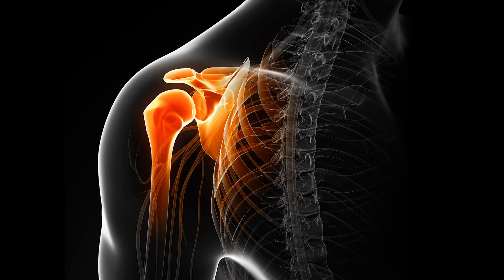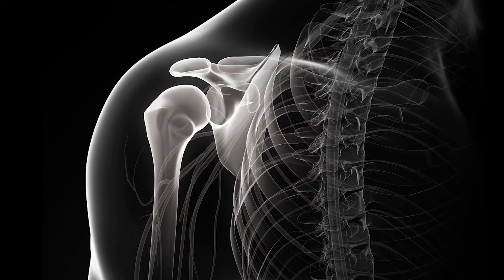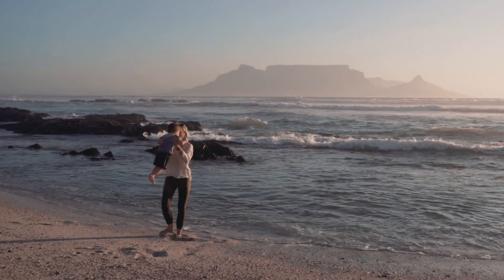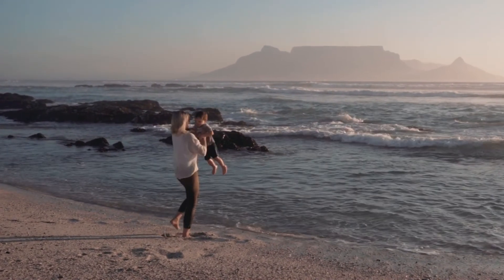Tensor is the first and only reusable arthroscopic tunneling system with no foreign body implants. Studies show the transosseous repair has excellent long-term clinical results with improved postoperative pain scores and a lower revision rate.